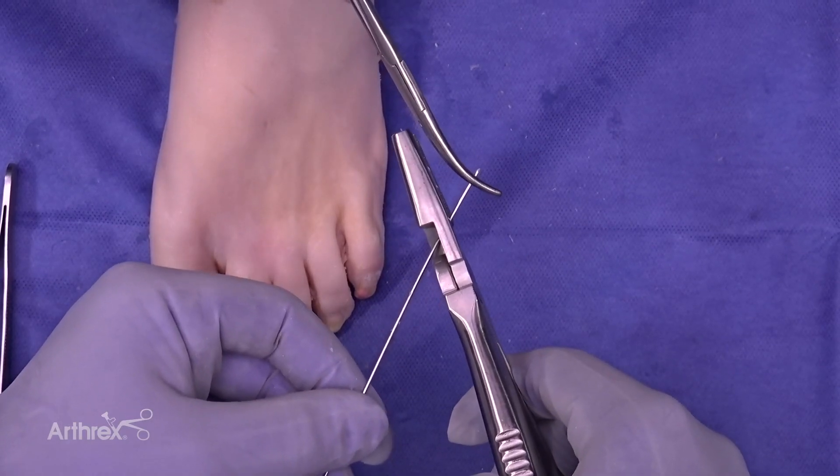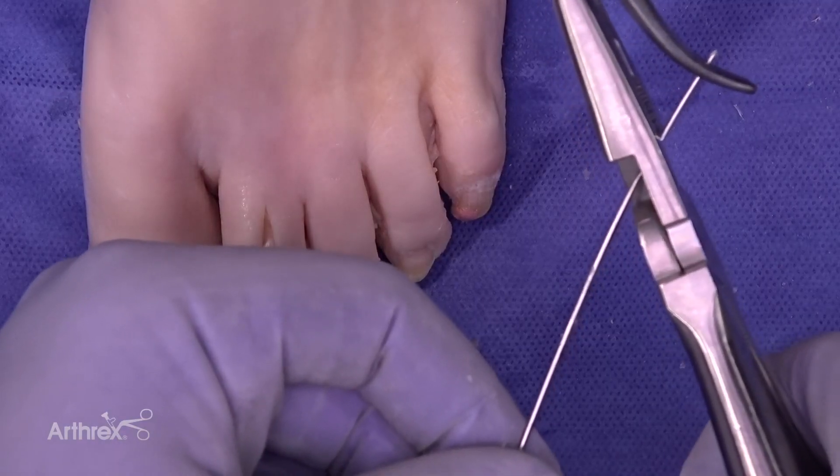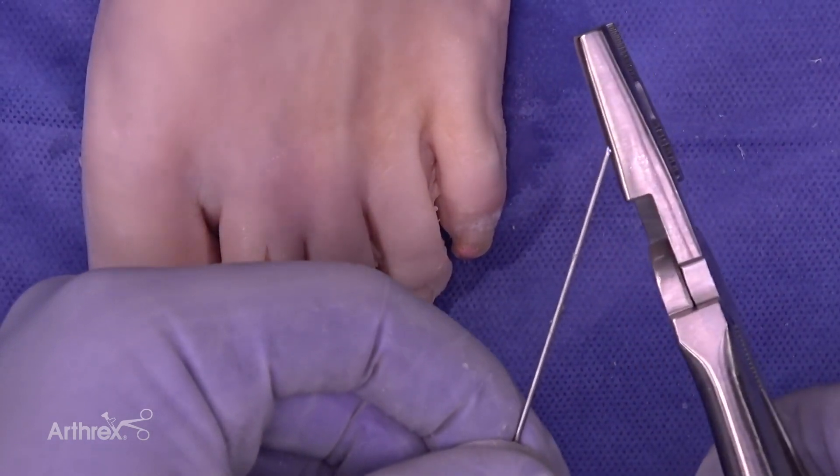At this point we're going to go ahead and cut the wire where we marked it, so it will end at the most proximal aspect we marked in the second metatarsal. It's recommended to leave a little bevel on it — cut it at an angle.